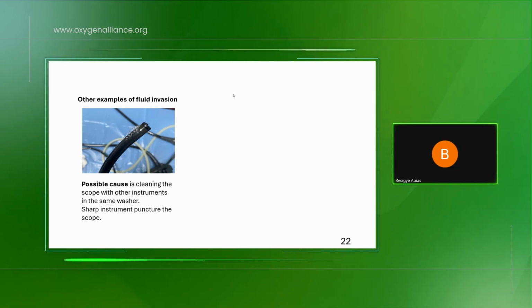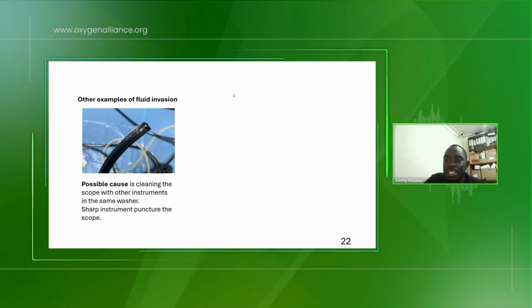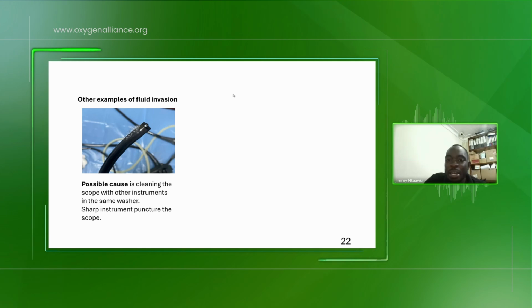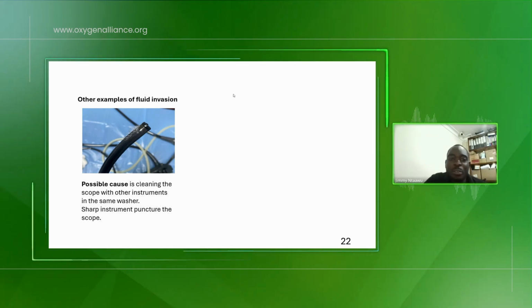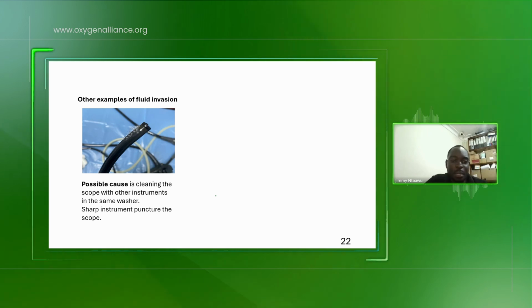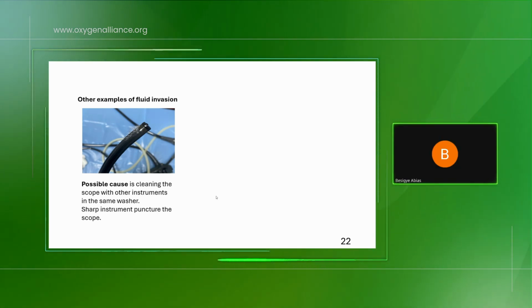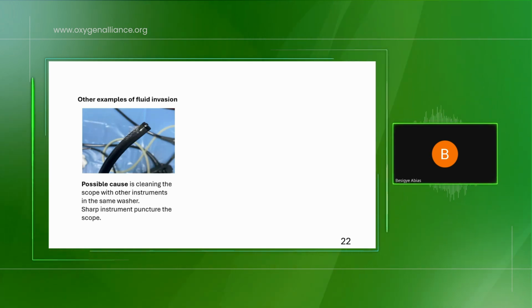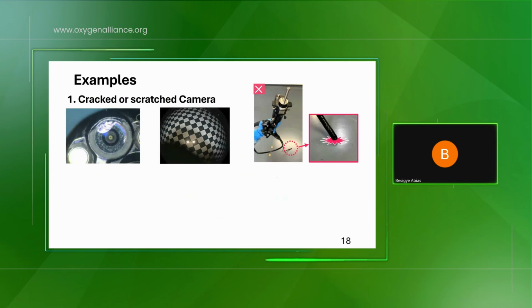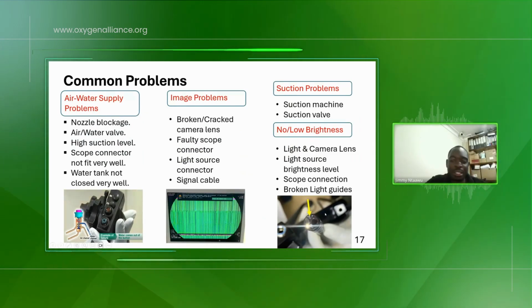The flexible. In the flexible scopes, we don't need a light cable, unless you're telling me it's for this particular scope whereby it's the light guide inside the scope that is faulty, like the one I showed you of one eye. So one eye is major repair, and maybe I'm going to send you a photo. I am going to inbox you a photo of what is needed. Okay, thank you. Yeah, this is one eye. One eye is major repair.